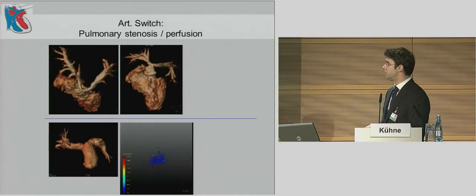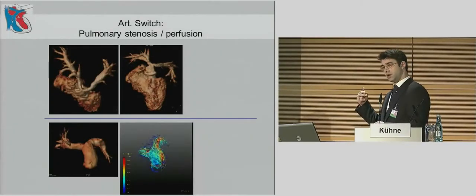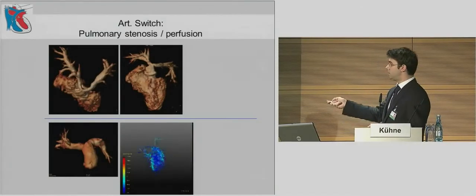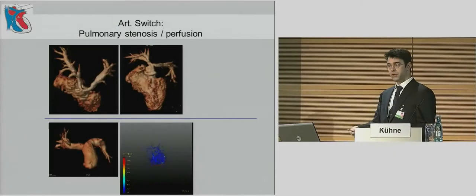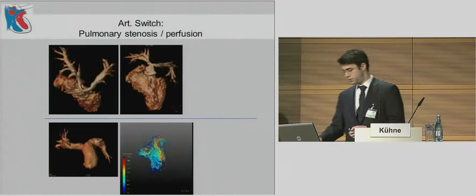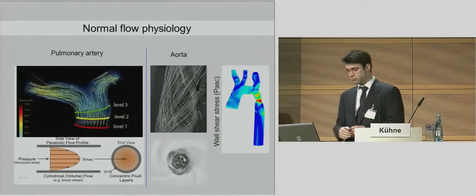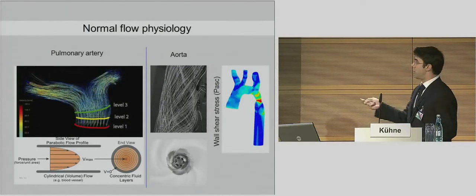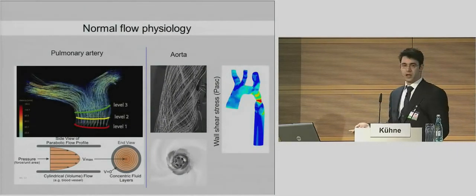Of course, here we would not consider that, only theoretically, so that we feed our computer with the data about anatomy, about flow, and it spits out a recommendation because it can foresee the outcome of such an intervention. So how should normal blood flow in the pulmonary artery look? It's pretty much straight aligned.